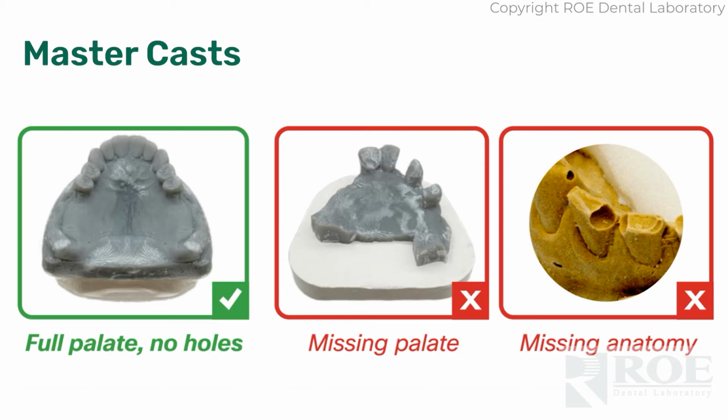The master casts. The master casts are very important. They are what help us set the stage for case analysis and for the surgery to make sure the pin guide fits. So please always capture the full anatomy, all the landmarks. We can't use any quadrant impressions and impressions that don't include land areas, and then of course just make sure that they are pristine, don't have bubbles and voids, that type of thing.